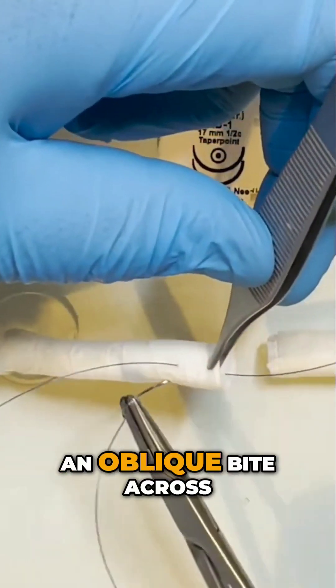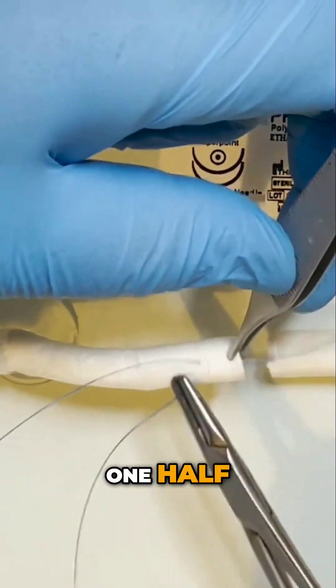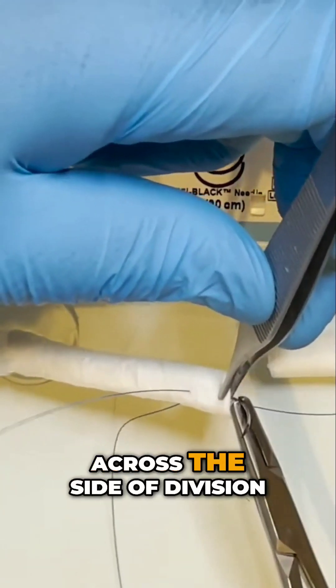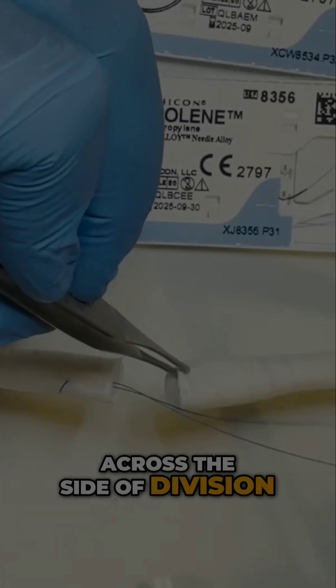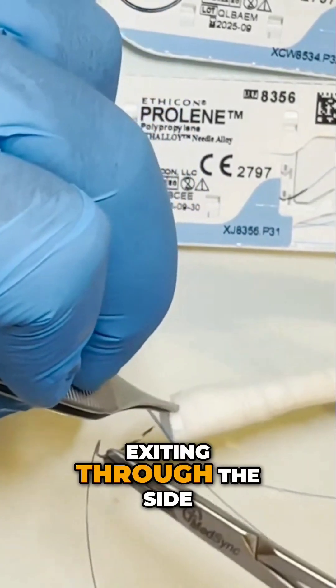This is followed by an oblique bite across the divided tendon from one half, across the side of division, and into the other half of the tendon, exiting through the side.